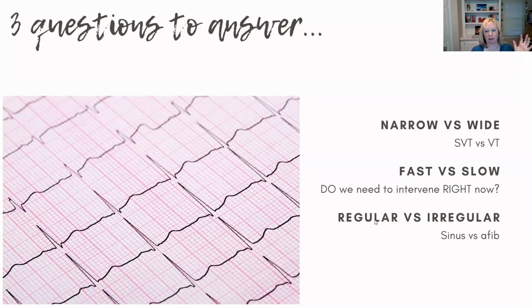Now, the last question you're going to ask yourself, in addition to whether there are P waves, because that's just a given, you're always asking if there's a P wave, is, is it regular or irregular?